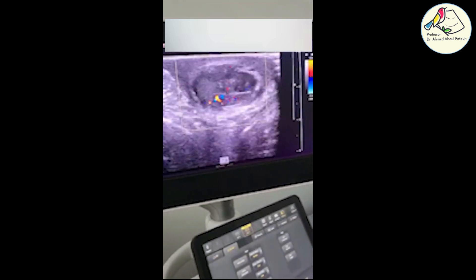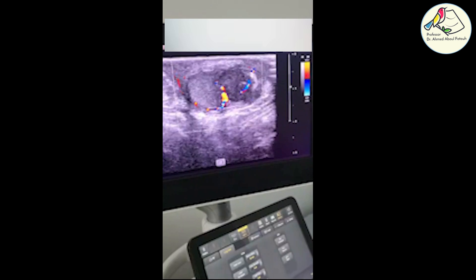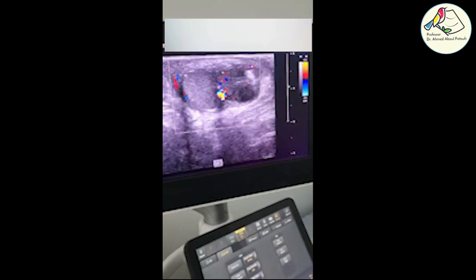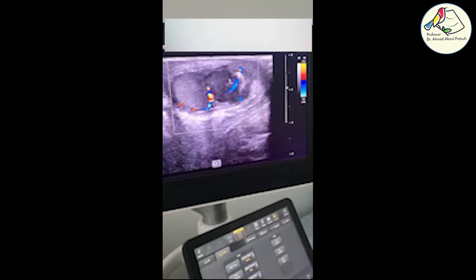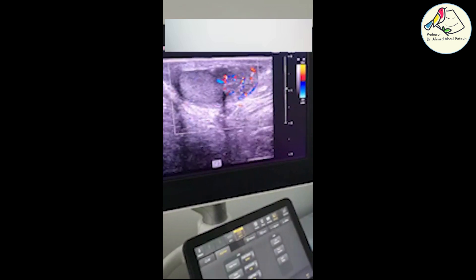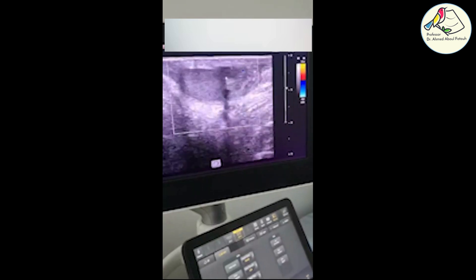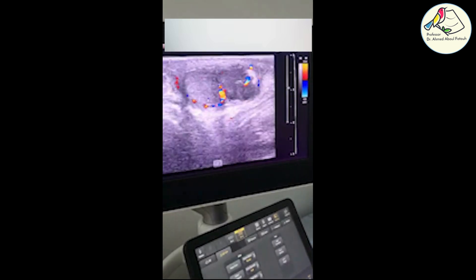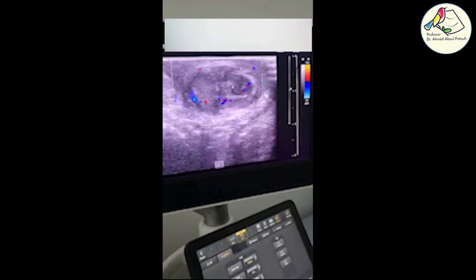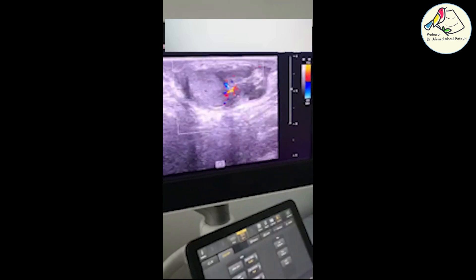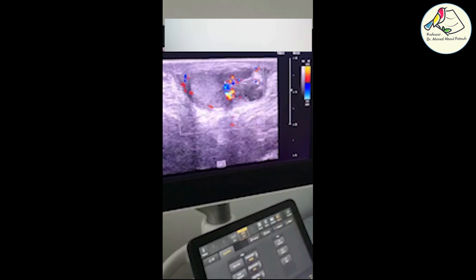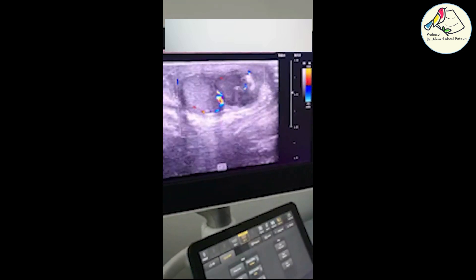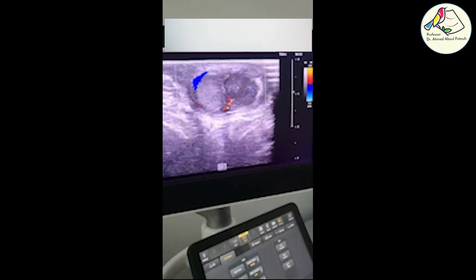Now we are checking for signs of differentiation — is it intra-testicular or extra-testicular? By color Doppler, we see all of these vascularities outside the testis. Here is the testicular tissue, which looks brighter than that region. There is a differentiating rim between the testis and the hematoma. This is our diagnosis.